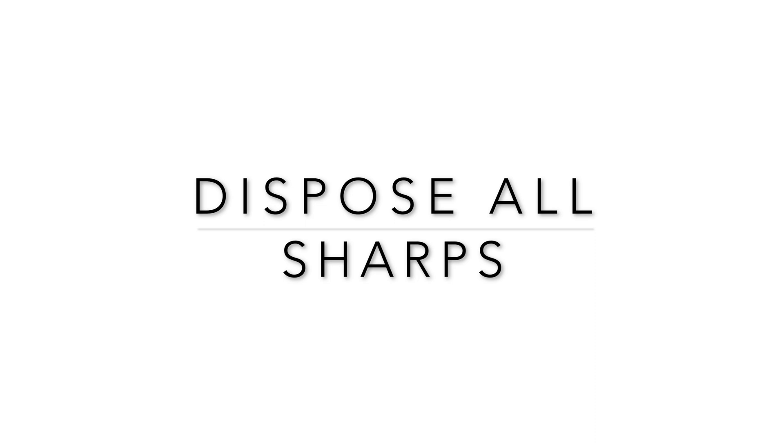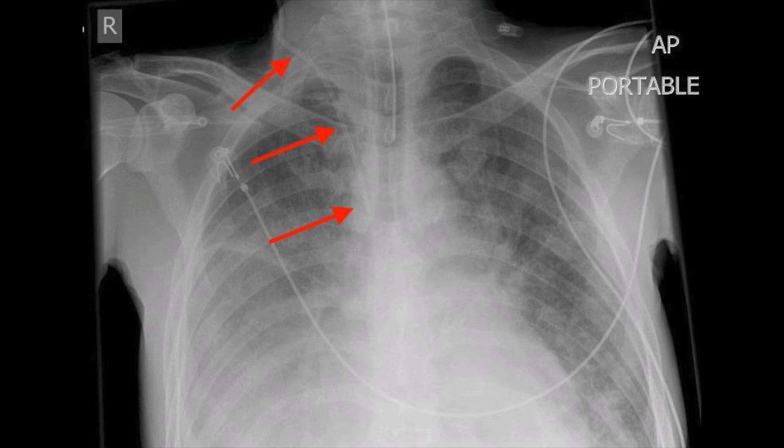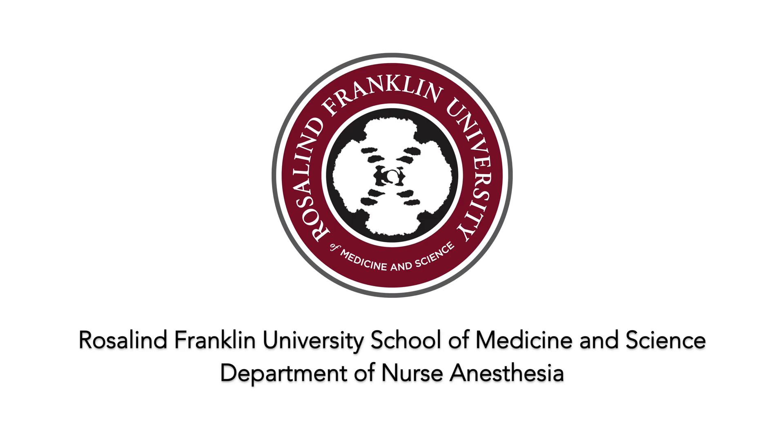Be sure to dispose of all sharps in the appropriate red bin. The gold standard to verify venous catheter placement is an anterior-posterior chest x-ray. Other alternative methods include pressure transduction, manometer testing, and blood gas comparison with an arterial sample. It is important not to rely on the color of the blood to confirm placement. Finally, document the line according to institutional policy. This concludes our demonstration on central line catheter insertion.